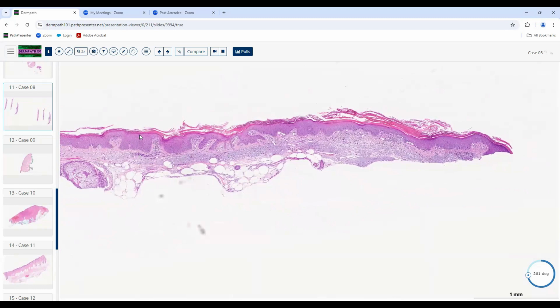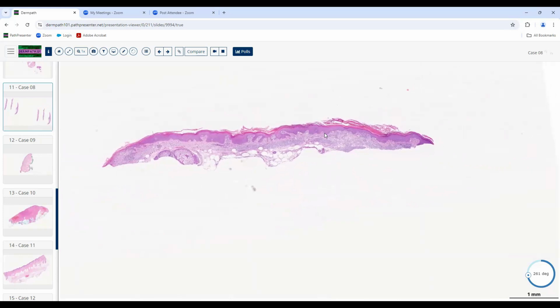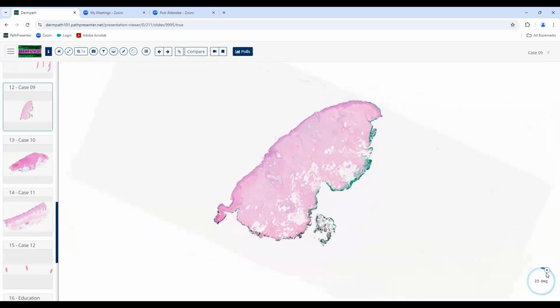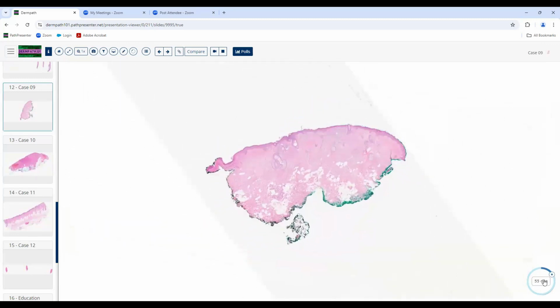You don't get the loss of the granular cell layer the way you do in psoriasis. You don't get the neutrophils in the cornified layer like you do in psoriasis. Rarely you can, in an atypical PRP, but if you see this pattern, this is kind of what you're getting on the board examination. You're not getting any of the atypical PRPs or anything weird. You're going to probably get a nice, deep, broad punch biopsy that shows those various features. And if you see acantholysis, that's going to be a helpful clue, and just remember that you can see that.